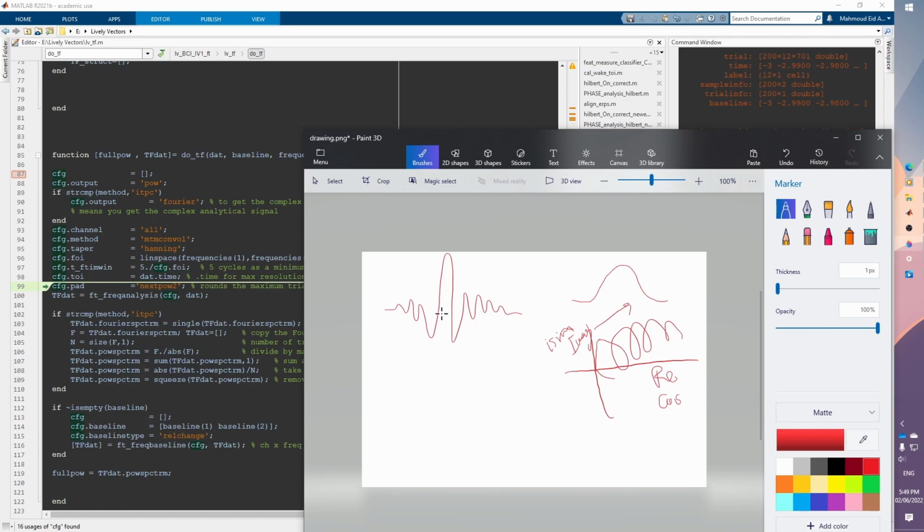The main idea is that this wavelet has a particular frequency. By the way, if you don't know what I'm talking about here, please check the video about the Fourier transform, where we discussed this in detail and we showed an animation for this. So after putting this Morlet wavelet on a specific frequency, now we have an oscillating wave. It's a rotating vector on a specific frequency. So we can now take this, and let's assume that this is 1 Hertz. This is put on 1 Hertz.